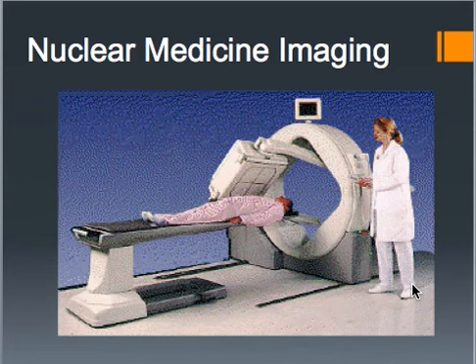Today we're going to talk a little bit about nuclear medicine imaging. So nuclear medicine imaging is just a little bit different than what we've discussed in the past. It's different than the other modalities. Earlier we learned about X-rays and CT and how they create images by passing those X-rays through the body. So they're actually passing radiation or X-rays through the body.